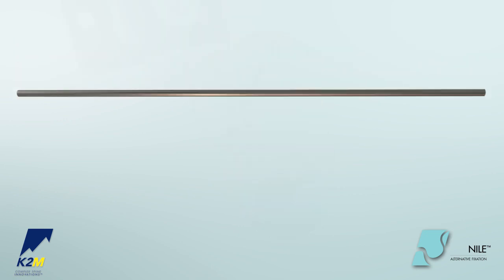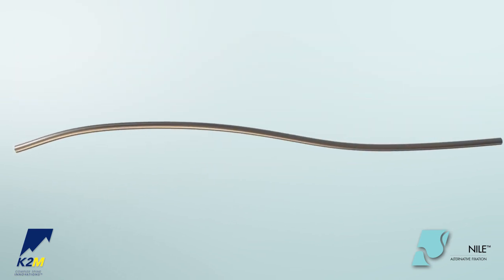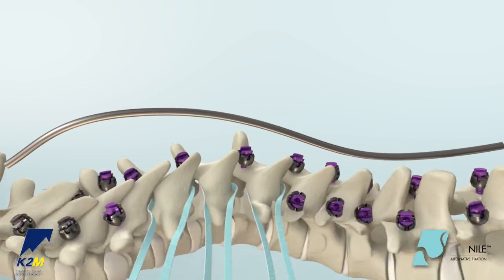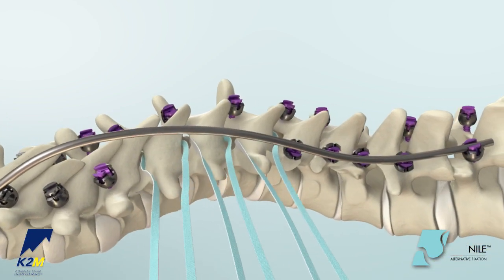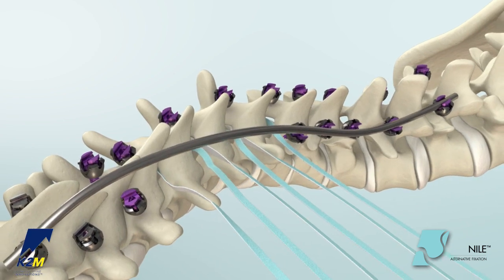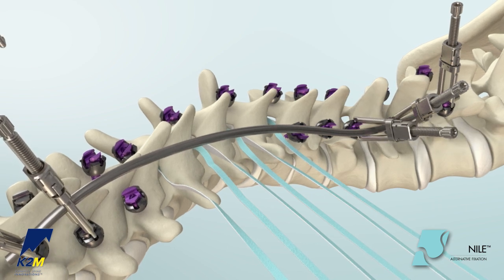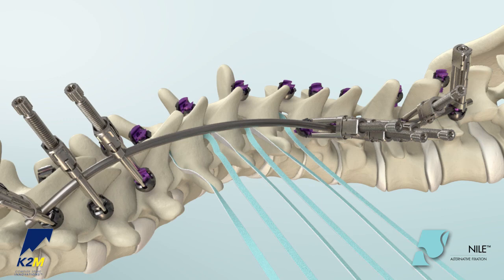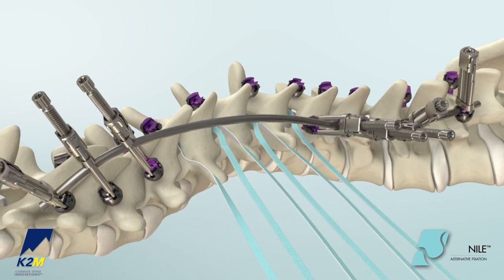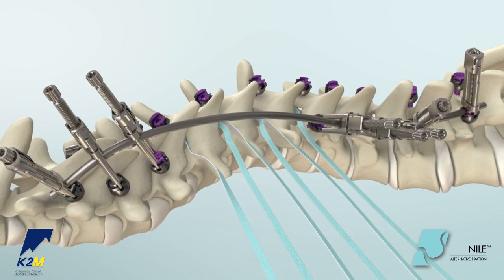After all the fixation points are in place, the rod is selected and cut to an appropriate length. Place the rod over the screws and or hooks. Confirm that both ends of the band are positioned underneath the rod, then apply crickets and tensioners where desired to hold the rod in place. When using more than one clamp and or cricket, applying all crickets and tensioners first allows for sequential reduction, reducing stress on individual segments and optimizing the correction.